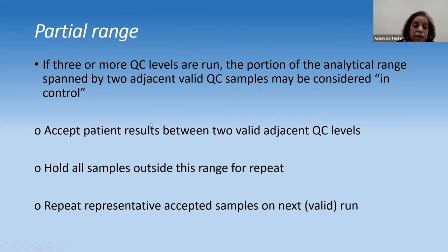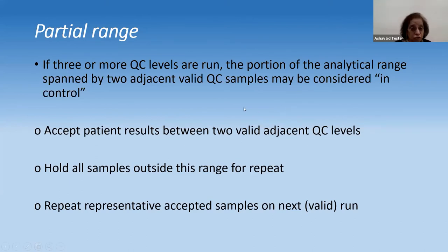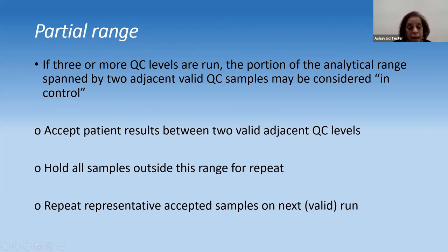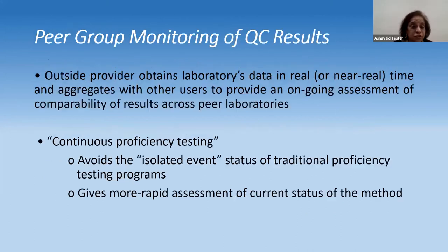If you run three control levels of QC, the portion of the analytical range spanned between two adjacent valid QC samples is considered in control. Accept patient results between these two adjacent QC results. If something goes beyond your quality control ranges, hold that sample, dilute if needed, repeat it, and repeat representative accepted samples on the next run.